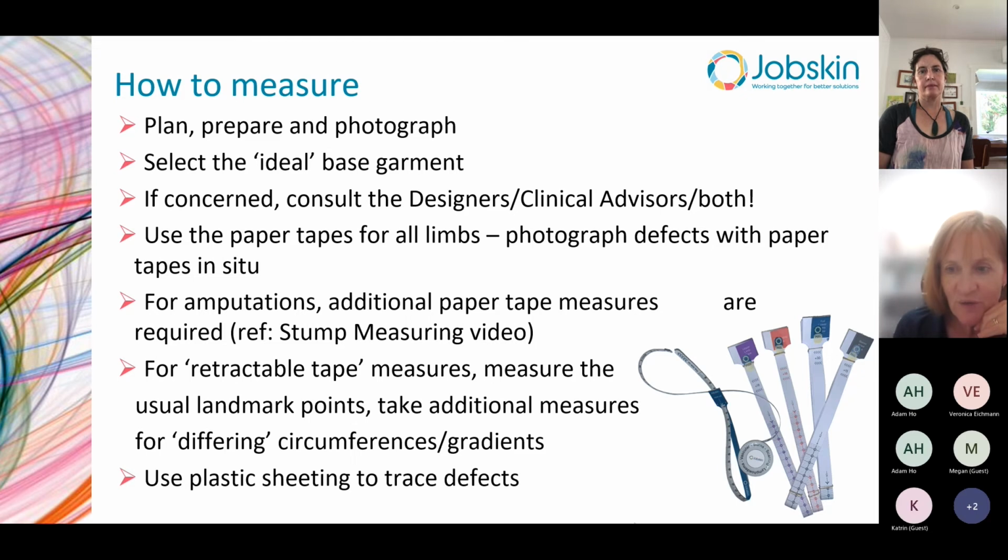But he needed bike shorts with modifications. We needed to accommodate the stoma. We needed to accommodate the suprapubic catheter. We needed to take some extra torso measurements because he had a significant area of bulging tissue on one hip. We needed to take those measurements by rolling him in bed. So it's not as simple as taking the measurements in standing, but actually when we really got down to brass tacks, that was pretty much the only modification that we were making in our process.